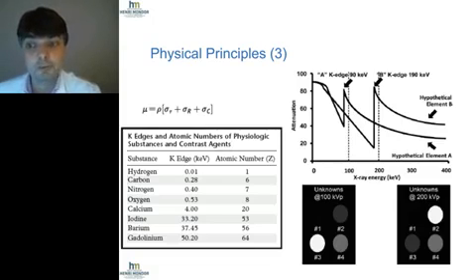And if you know the attenuation profile of a specific material and you put it in the system, well, then you're able to reconstruct whatever tissue you want made as a composition of those two different components. And if we look at the K edges of the different components that we could image in clinical practice, well, there we go. Iodine has a high K edge as opposed to, for example, water. So the idea here is that you can actually decompose a material based on using two different materials of different components and showing different attenuation values.